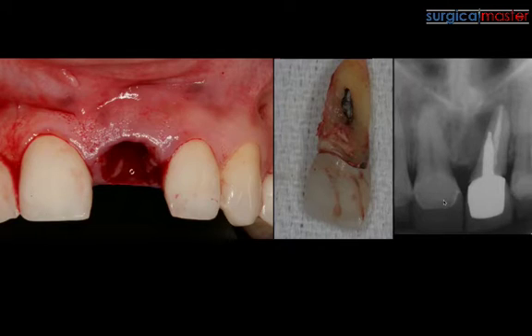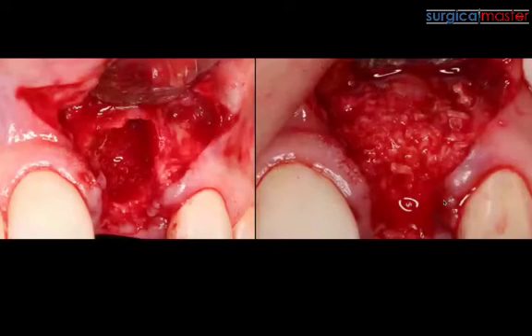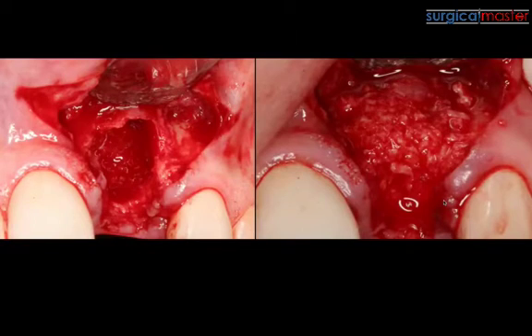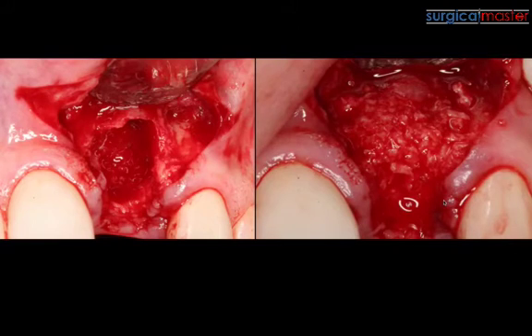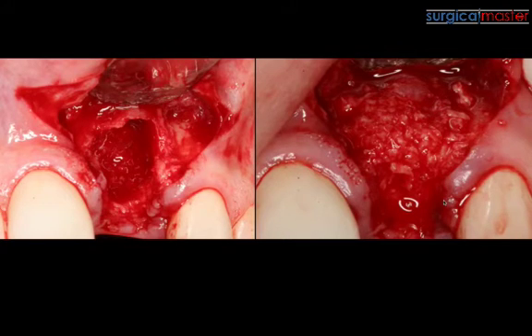So this tooth had obviously a big crack, a big perforation, and as you reflect the tissue, you can see the extent of the loss of the buccal plate. You can see quite a bit of bone loss. You can see that we have the interproximal bone and tissue, but the buccal plate is very compromised.